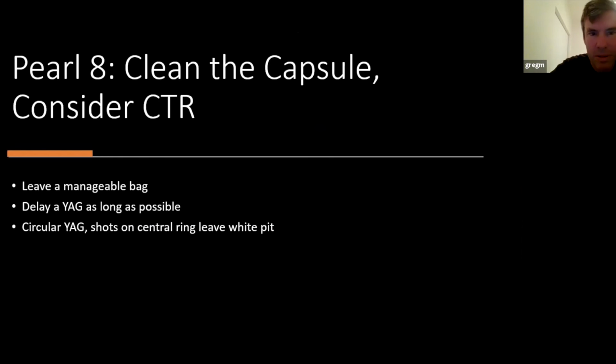The general tips that I impart about using it are, there's no specialty lens that I've put in that I've never had to take out in some percentage of patients. And in patients with irregular corneas, I noticed, John, on one of your slides, there was an exchange rate pre intraoperative aberrometry as high as 26%. I think you've got to be prepared for some big misses when the calculations are so, and David, you will attest to this, that sometimes you do your best, you collect as much data as you can, and your refractive misses are quite wide.